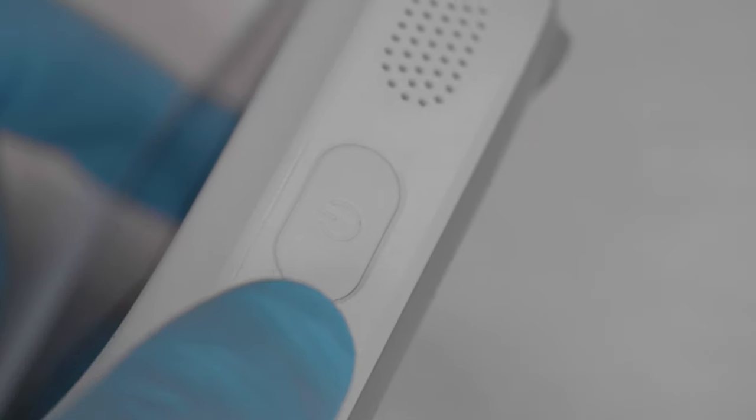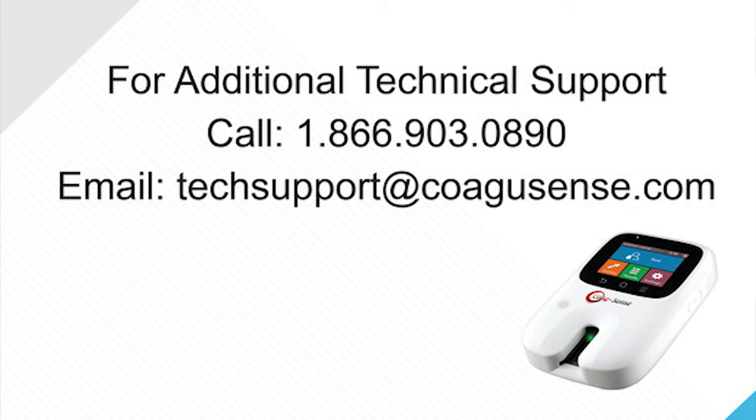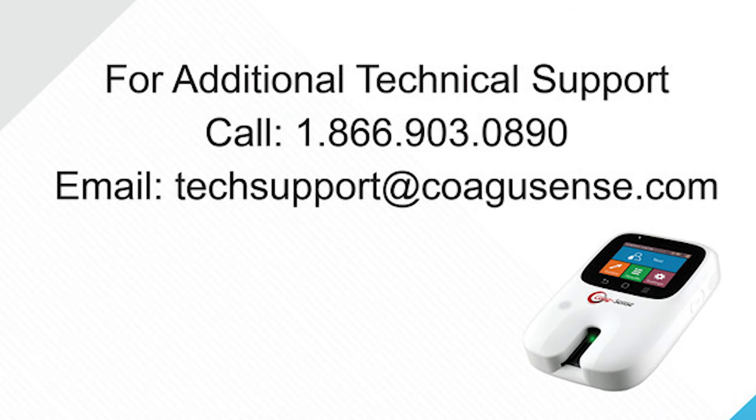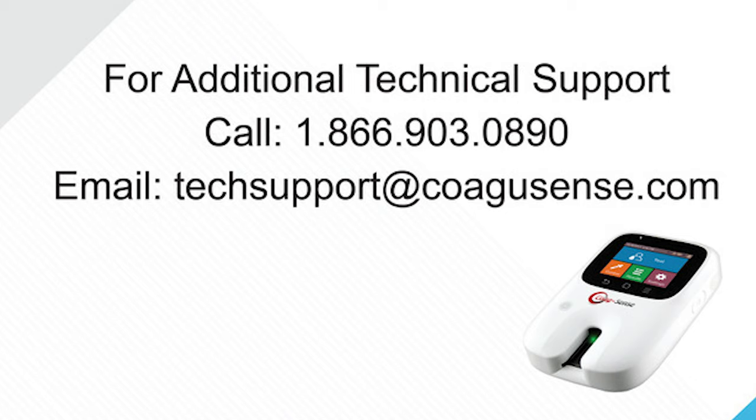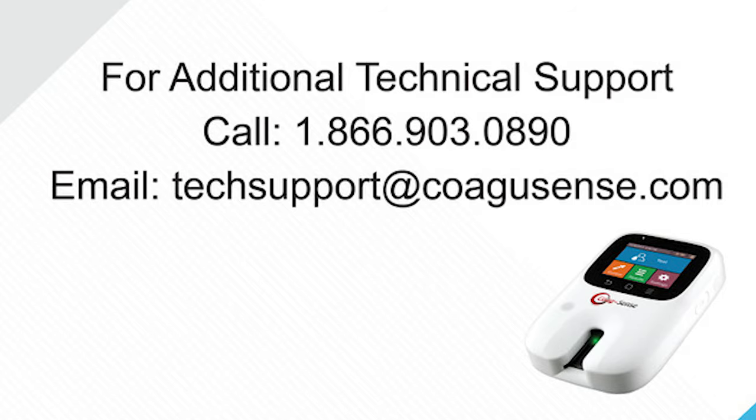Remove the test strip and properly dispose along with the sample transfer tube and lancet. Turn the meter off by pressing and holding the power button when you are finished testing. For unexpected results, contact Coagusense Technical Support at 1-866-903-0890 or via email at techsupport@coagusense.com.